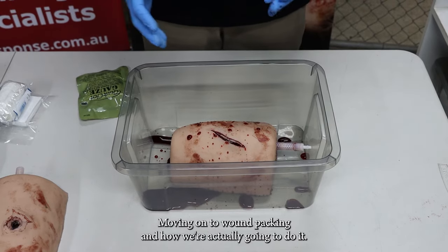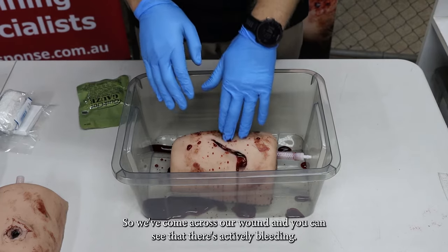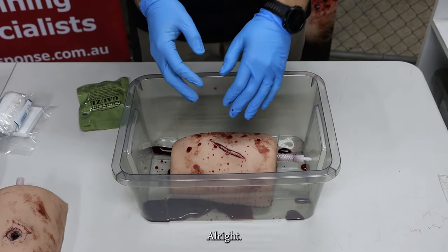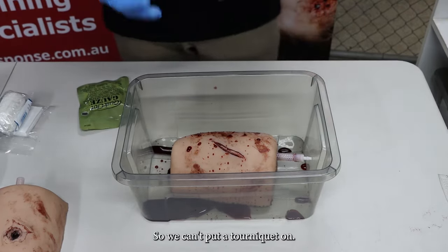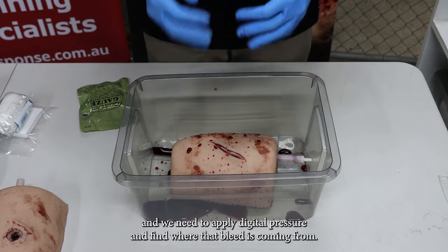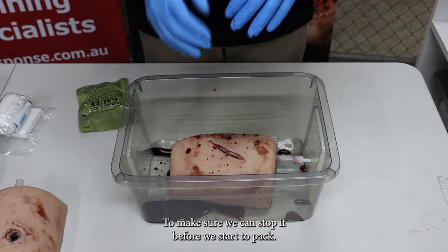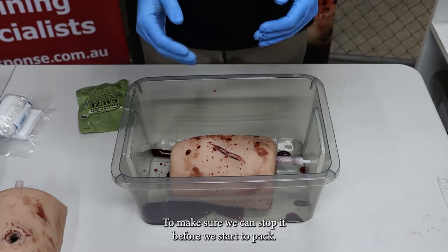Moving on to wound packing and how we're actually going to do it. We've come across our wound and you can see there's active bleeding coming out of it. It's up in the groin so we can't put a tourniquet on. So the first thing we need to do is go in and apply digital pressure and find where that bleed is coming from to make sure we can stop it before we start to pack.